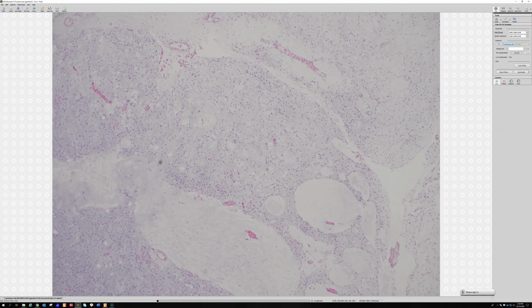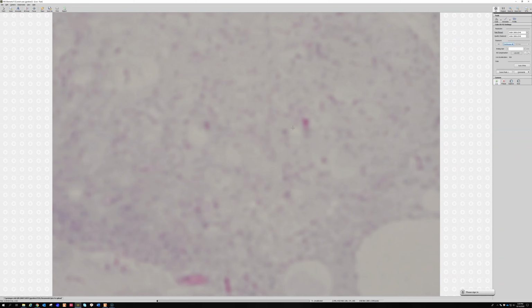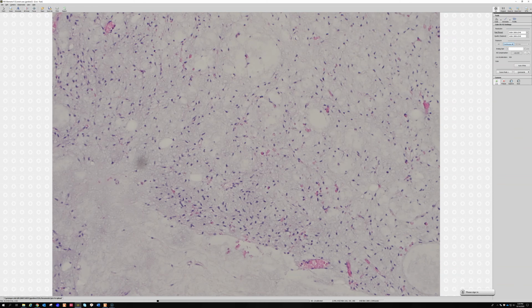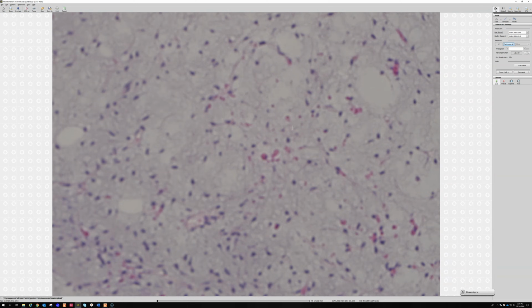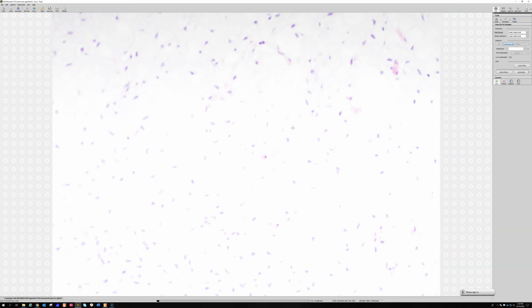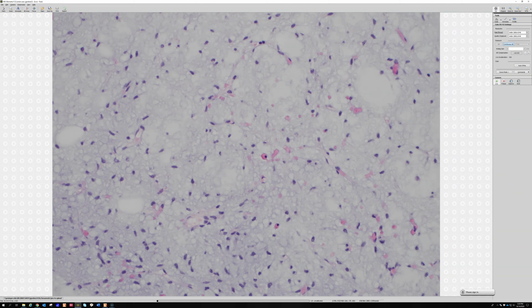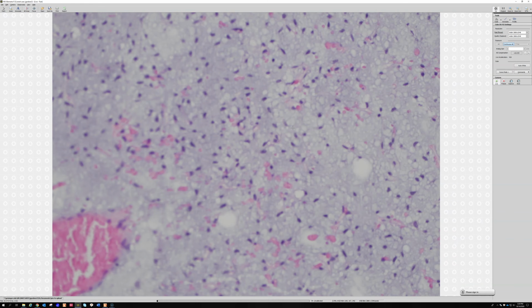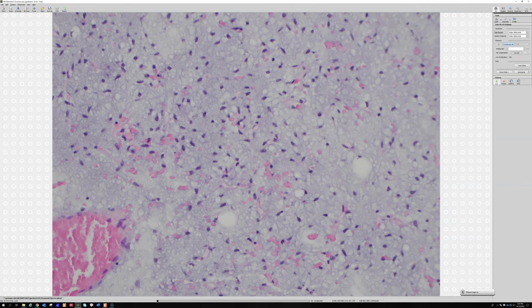Even for the low grade, grade 1, you've got to have at least scattered cells that are truly atypical. But these guys, not a bit, right? They are totally bland, little kind of oval to spindled, or even almost round, depending on the angle of the section. Very, very tiny little cells. They're not touching their neighbors. They're nice and socially distanced, right? They're spread out from their neighbors. They're not making nests or cords or chains.